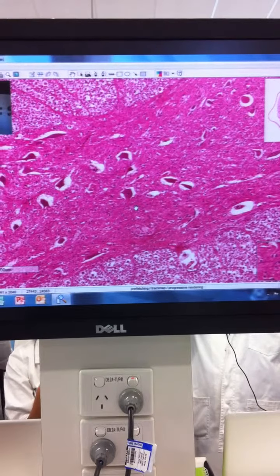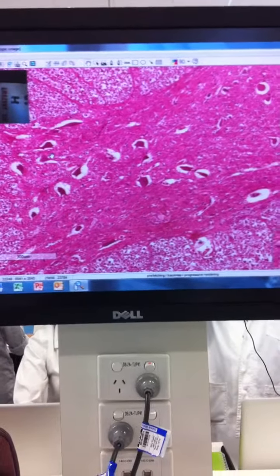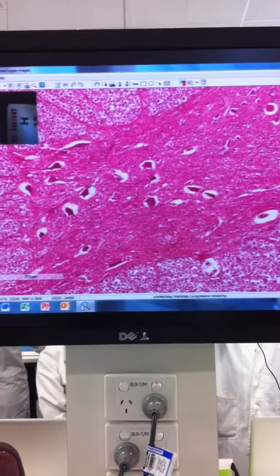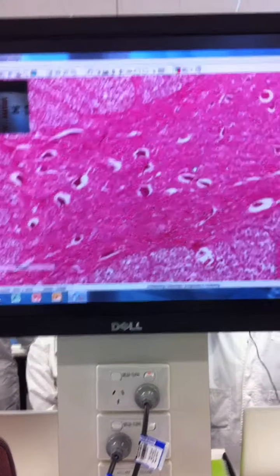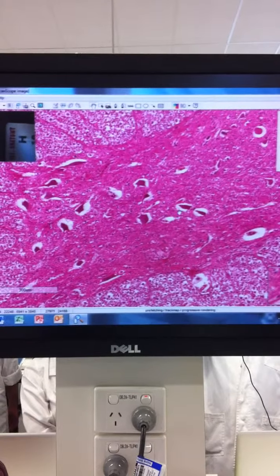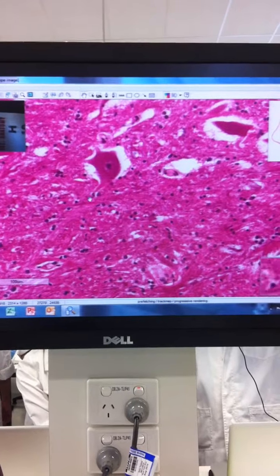There's the ventral horn. It's very characteristically different because it's got these big pyramidal cells. And they're the motor cell bodies, or the motor neurons. So by looking at it, you can see it looks very different because you've got these motor cell bodies. That's very characteristic of the ventral horn. Remember that sensory comes into the dorsal horn, motor leaves by the ventral horn. And these cell bodies, the motor nuclei, are here. You can look at them in higher power if you wish. You've got processes coming off, which is the motor neurons.